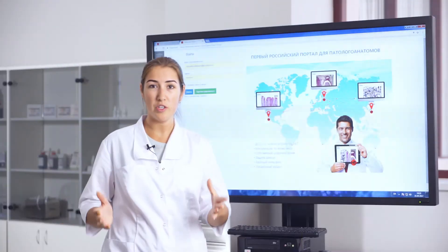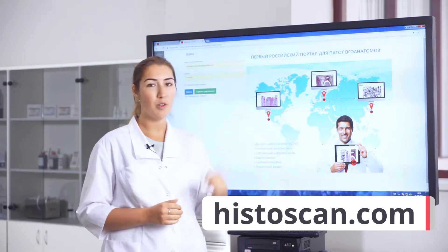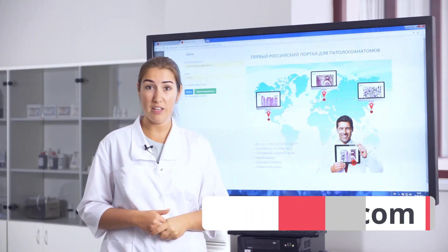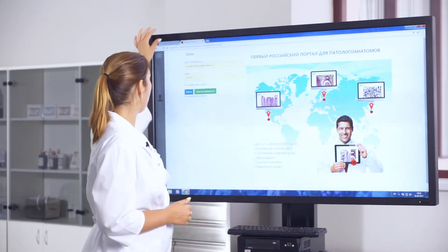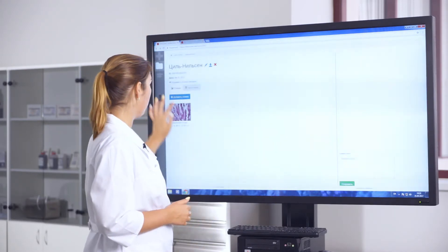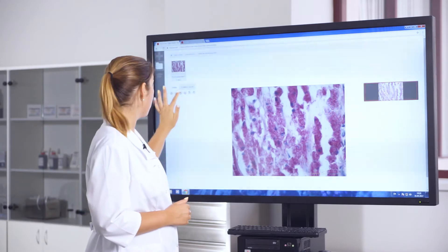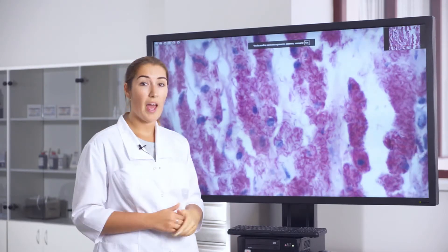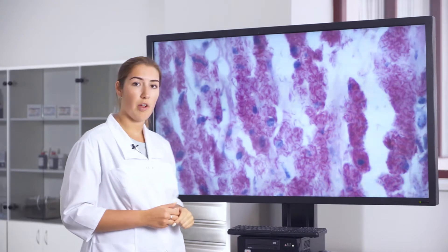To watch stained slides we go to histoscan.com. It's a special portal where you can save and share scanned images. We have a sample of myocardium tissue which was stained with Zyl-Nielsen method and we can see a lot of acid fast bacteria all around the tissue.